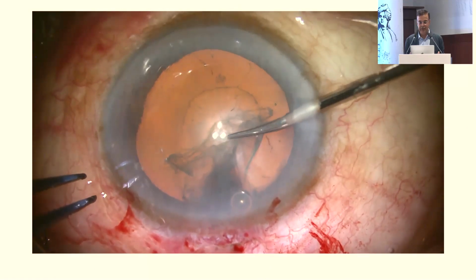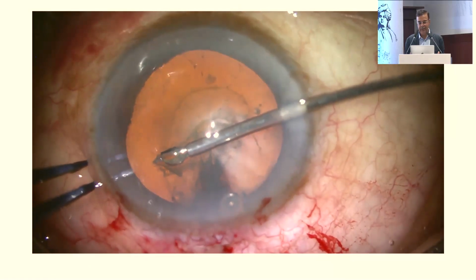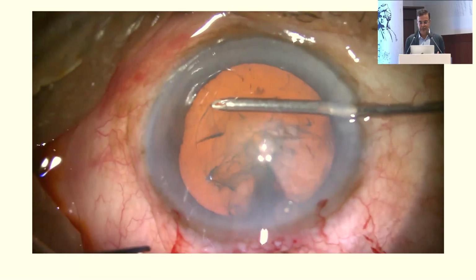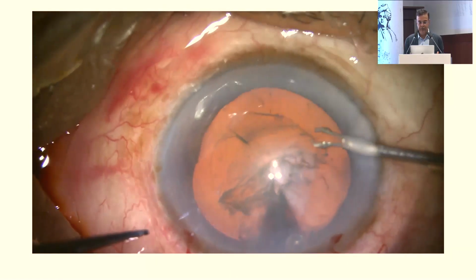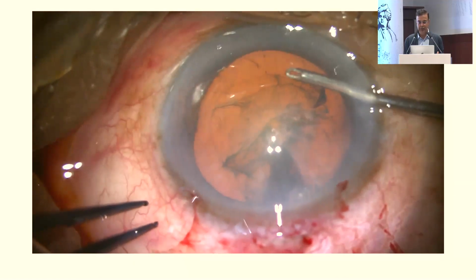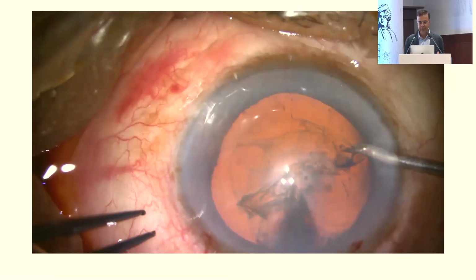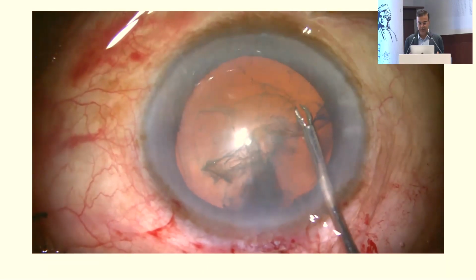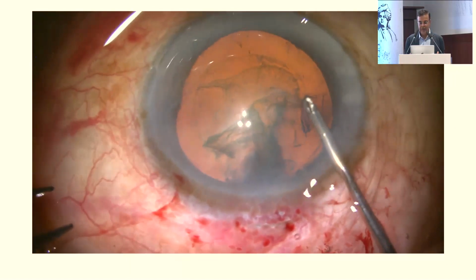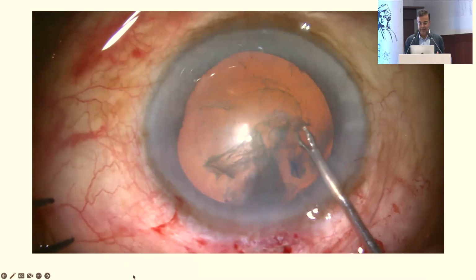direction in which to give that cut, because it should be slightly parallel to the area where you're planning to do this, not radial. And then you try to fashion a bigger rhexis than you would normally do, because now you need more room. It's a runaway rhexis, and maybe it has gone to the posterior capsule as well. We won't know about it till we start surgery, and that's where the flap motility sign will come in handy.